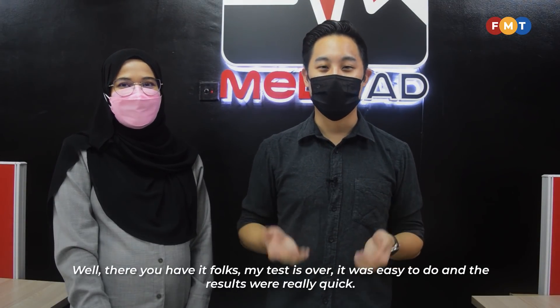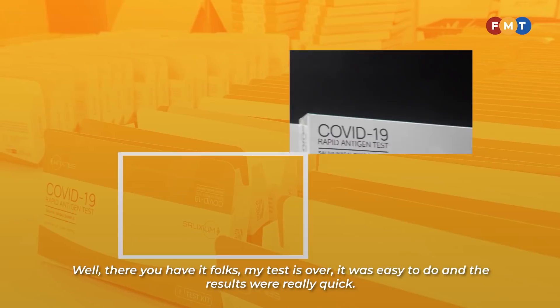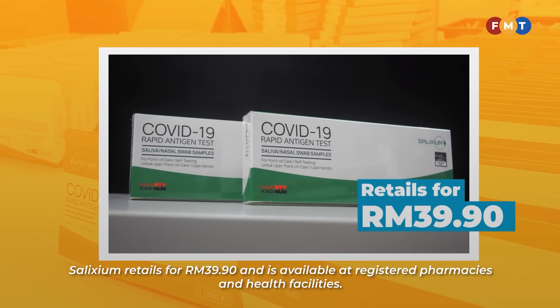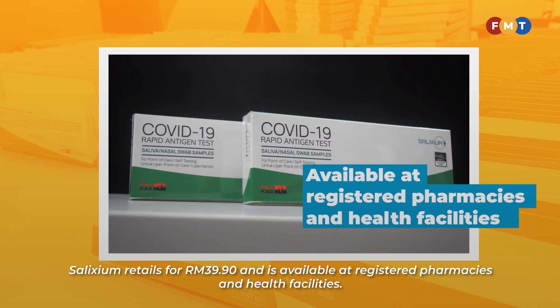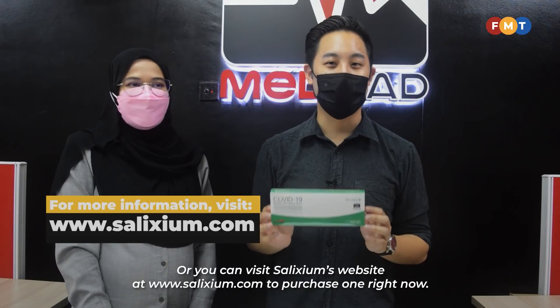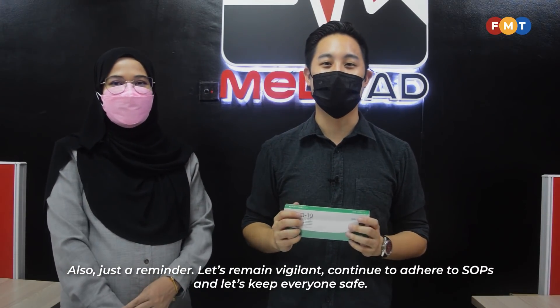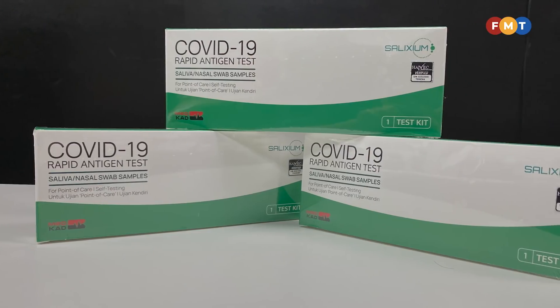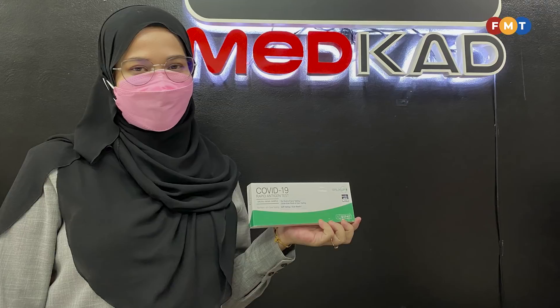Well, there you have it folks. My test is over — it was really easy to do and the results were really quick. Solixium retails for RM39.90 and is available at registered pharmacies and health facilities, or you can visit its website at www.solixium.com to purchase one. Let's remain vigilant, continue to adhere to SOPs, and let's keep everyone safe. Thank you.